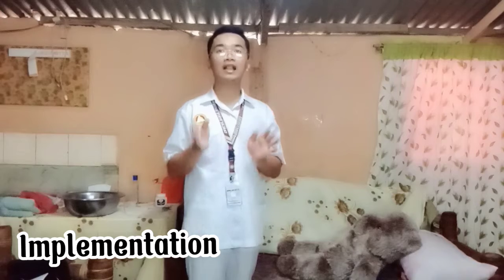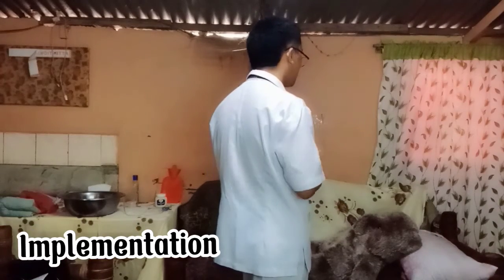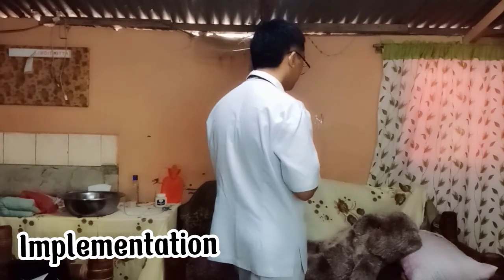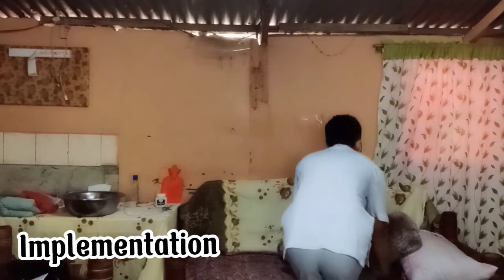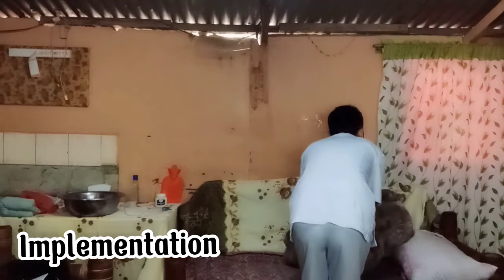Then after that, we're going to assist the client in a left lateral position with the right leg acutely flexed as possible and the linen saver pad under the buttocks. So ma'am, I'm going to assist you po in a left lateral position. Okay po, so I'm going to position you po in a left lateral position.